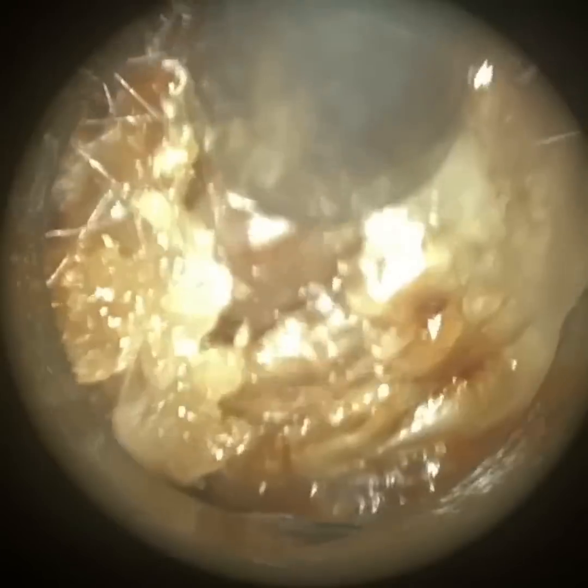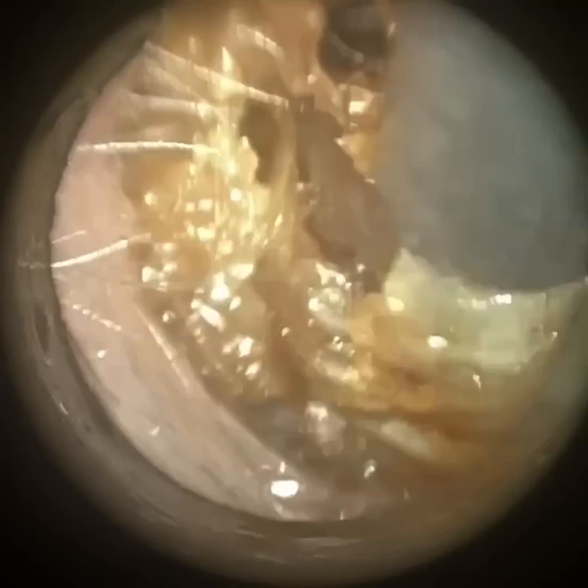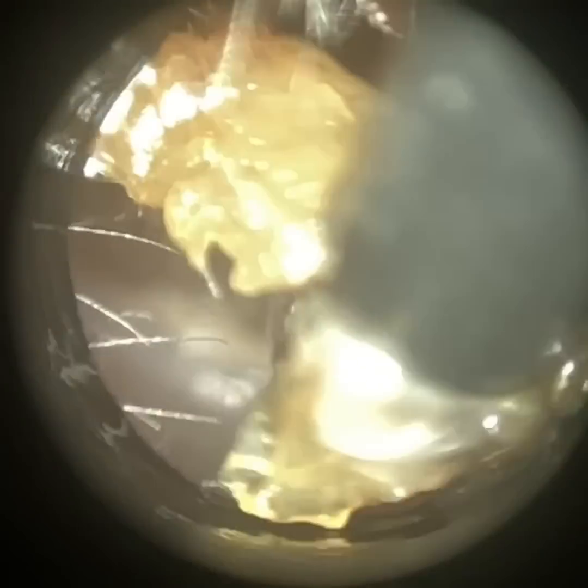And with keratosis obturans, the epidermal plug gets so large that it compresses against the canal wall, and it can cause otalgia, ear pain, and a remodeling, a reshaping, if you like, of the ear canal. And this remodeling, this widening, is global, so it's around the complete circumference of the bony part of the ear canal, which this patient didn't have, and they didn't exhibit any pain in the ear. But this is mainly all skin. There's not much wax here.